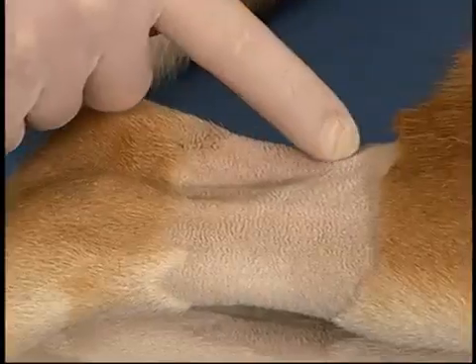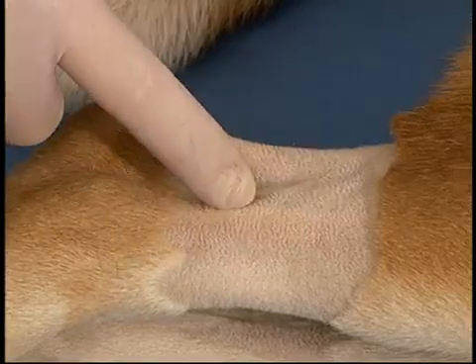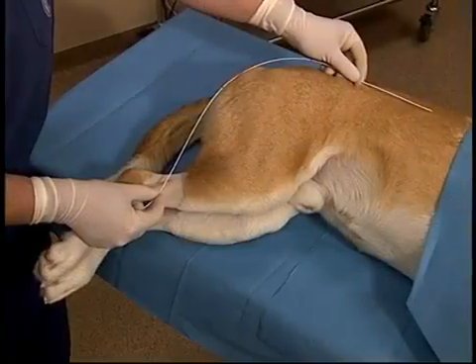The catheter will then be sutured to the skin. Typically these catheters are placed in the lateral saphenous vein of the dog or the medial saphenous vein of the cat.